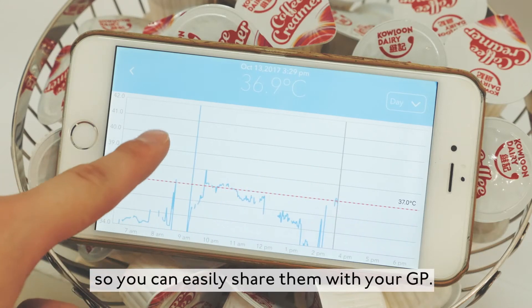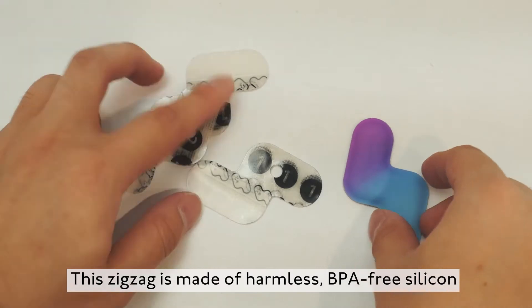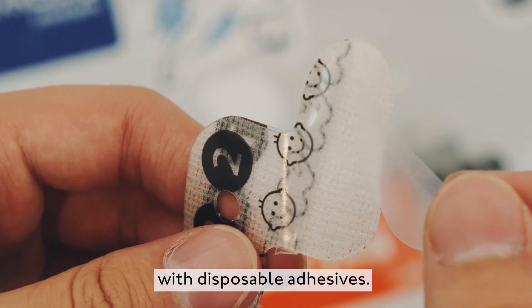Measurements are all logged so you can easily share them with your GP. The device is made of harmless, BPA-free silicone with disposable adhesives.